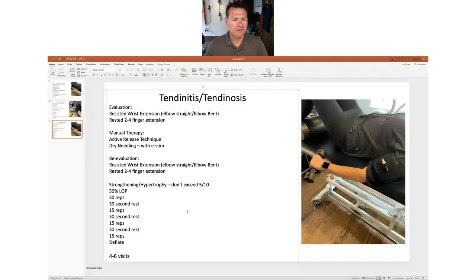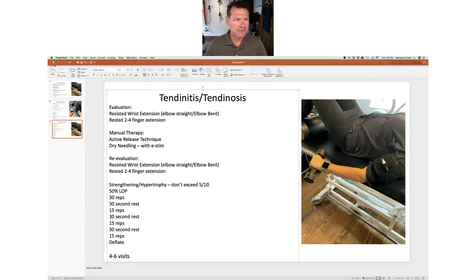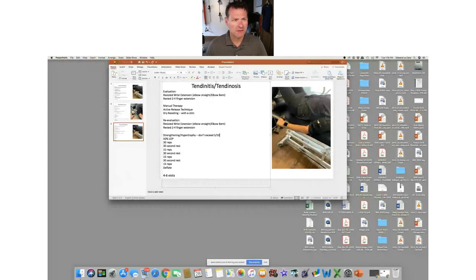Your 50% LOP with 30 reps. It's going to be pretty light loads. You're going to be taking them through this range of motion. It's a long duration, so loads are going to be lighter, and it should be pretty safe on the tissue at that point. If they can get up there and they no longer need BFR because they can lift 65% of their 1 rep max, then you can take them after this 4 to 6 visits into their normal lifting state. But that's usually what it takes to get them through these tendinitis, tendinoses.